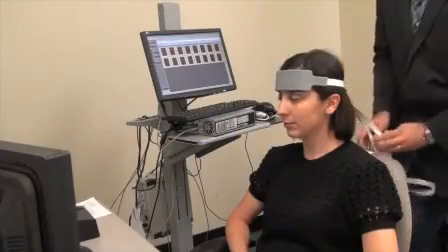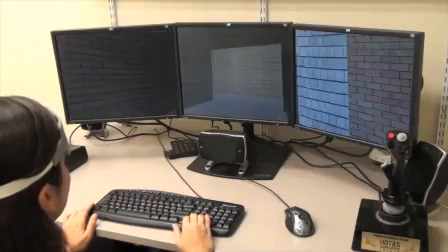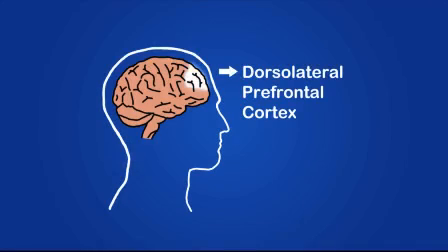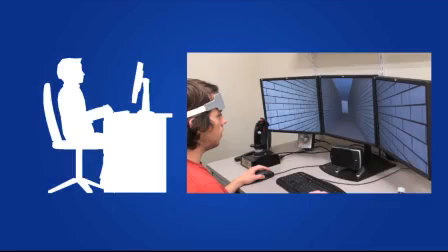To demonstrate these, a subsample from a study is reported to show how to use both Maze Suite and fNIR in a single experiment. The study involves the assessment of cognitive activity of the dorsolateral prefrontal cortex during the acquisition and learning of computer maze tasks for blocked and random practice orders.